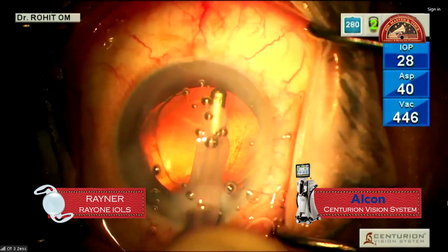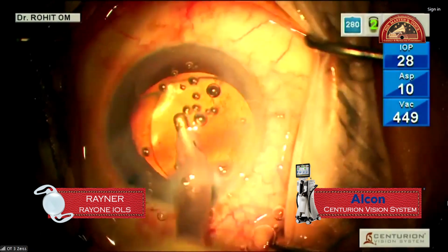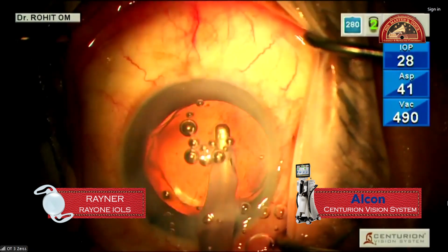You can use a femto. I think the IOL is well centered. The next important thing is what should be the timing for the other eye. That is another very controversial point, because if the patient is used to using a contact lens, you can postpone it. And if by any means a PVD is there in the other eye or in this eye, you can hasten the second surgery.